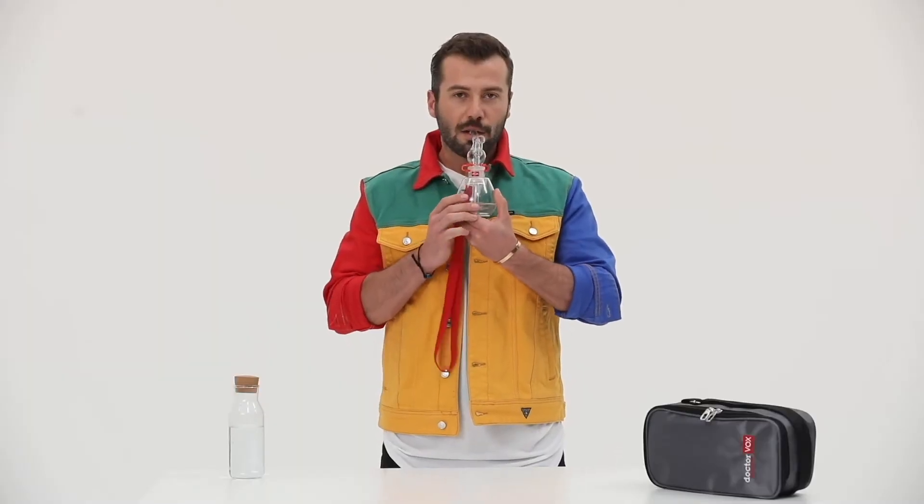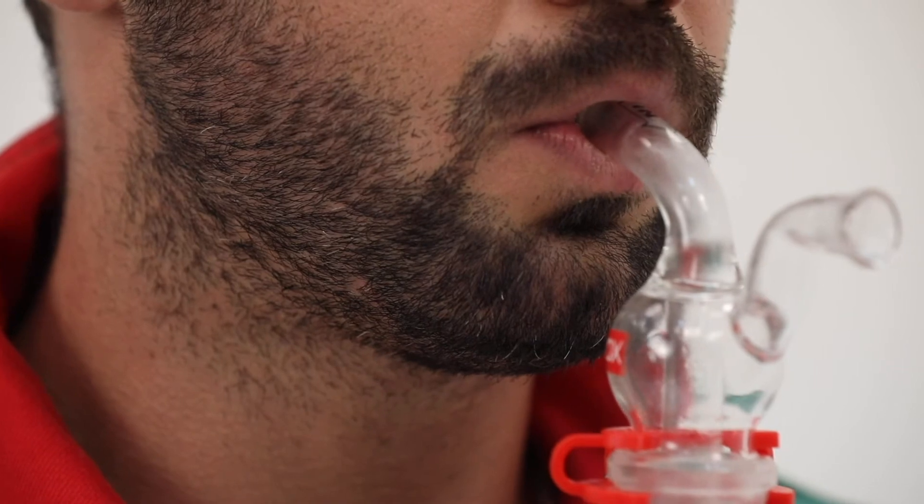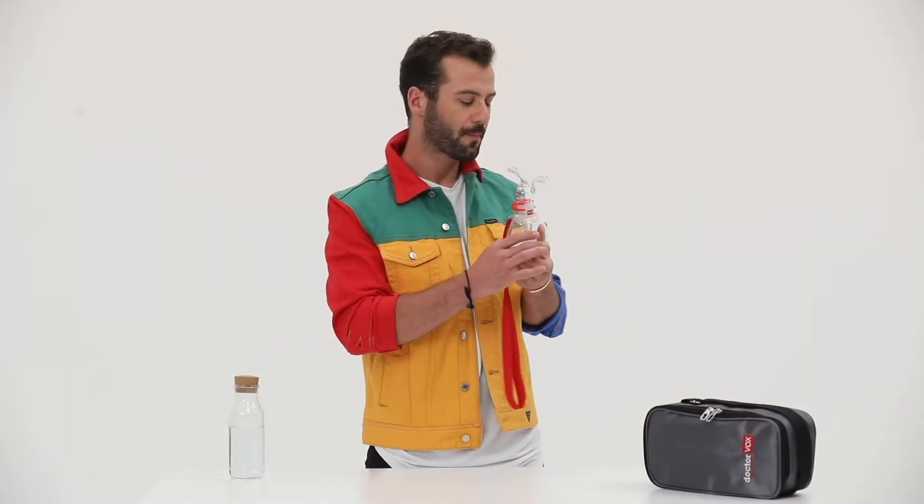When applying Dr. Vox Voice Therapy, the water level of the device has two main effects. One is the vibration that occurs during therapy and is observed in the cheeks. This vibration creates a massage effect in the vocal cords.